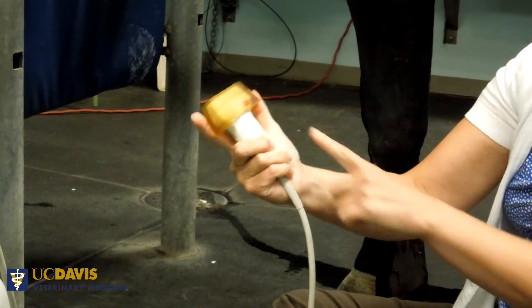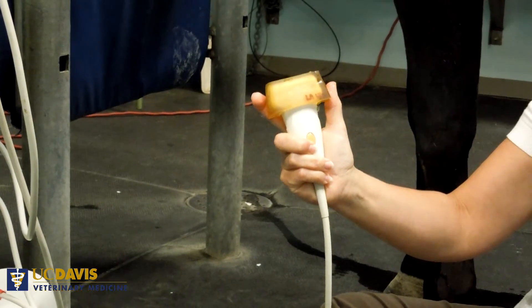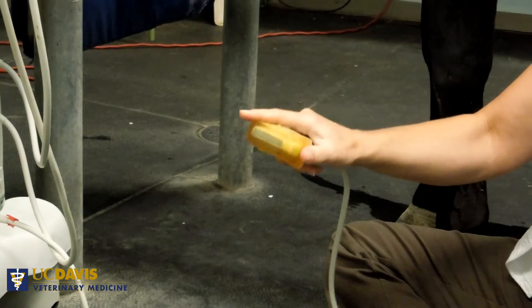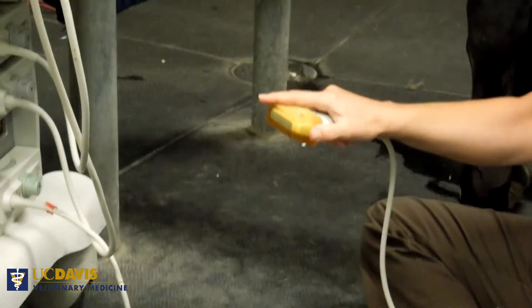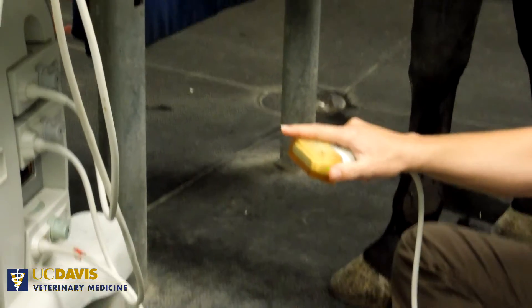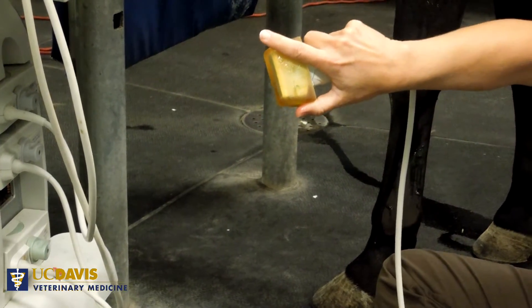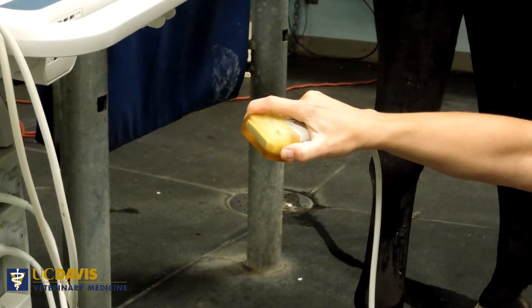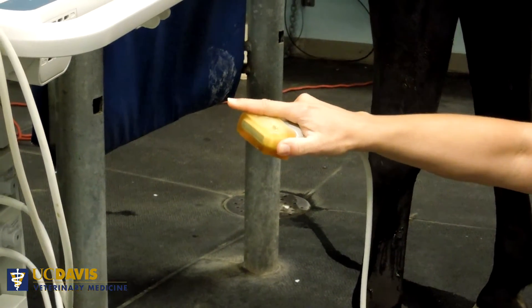When I hold the transducer, notice that I'm grabbing it with three fingers around the narrowest part of the transducer. Then as I hold the standoff — and this would be the same if I wasn't using the standoff — I lay my thumb on the lateral side of the standoff, and my index finger is laying across the top of the standoff. Notice that I'm not pulling that standoff back onto the transducer; I'm just merely going to guide it and hold it in place.